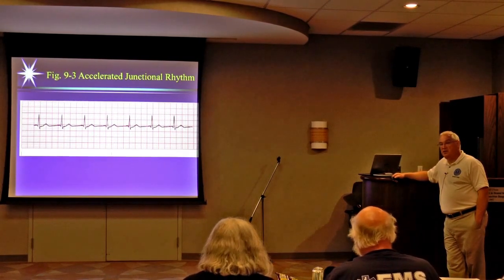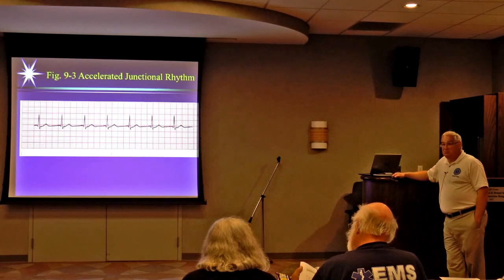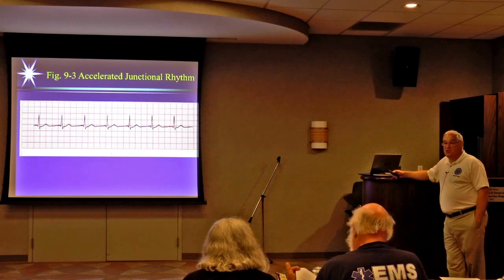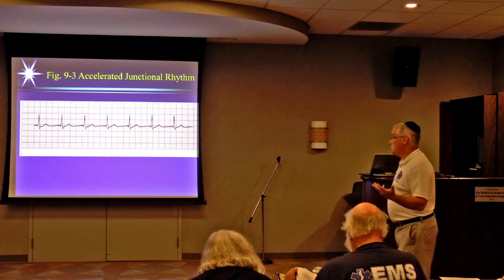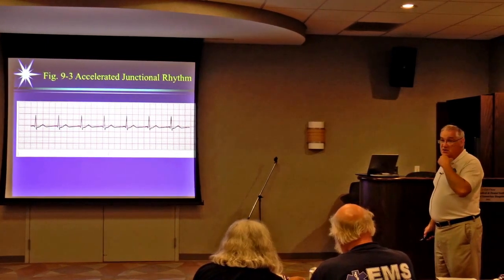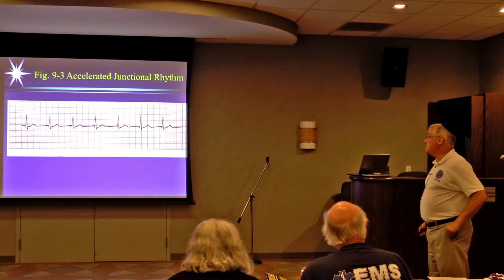And you're going to do a 12 lead, and you're not going to see any P waves in any of the leads. You're going to say, "Did the doctor ever say you have anything wrong with your heart?" He's like, "No." And the patient's probably totally asymptomatic, because this is a normal heart rate. The only thing that's different from a normal sinus rhythm is the site of the pacemaker. That's all it is. Obviously, this is not a patient where you could say stay home, because they're down to their backup pacemaker. Now, if this fails, they're going to go real slow. So they need to find out why this is happening.